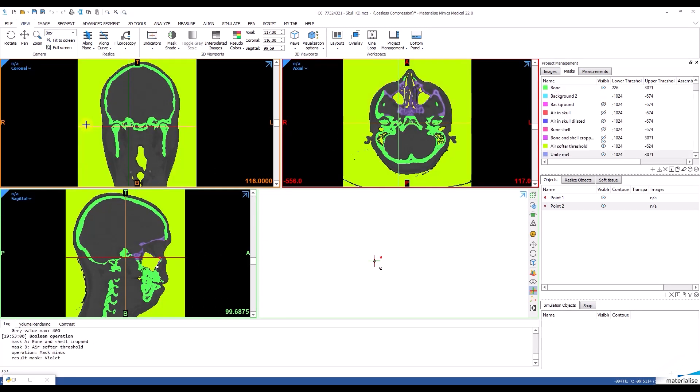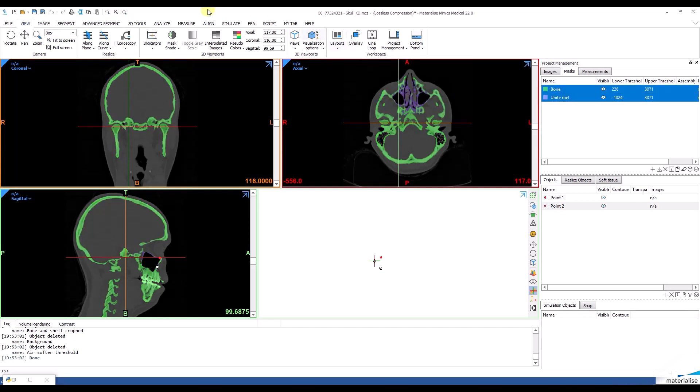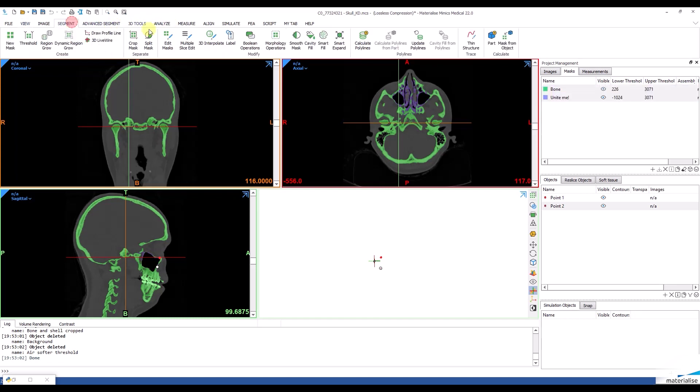The script will then do all steps needed to fill the cavities in the bone. After that, I will unite the two masks by doing a boolean operation.